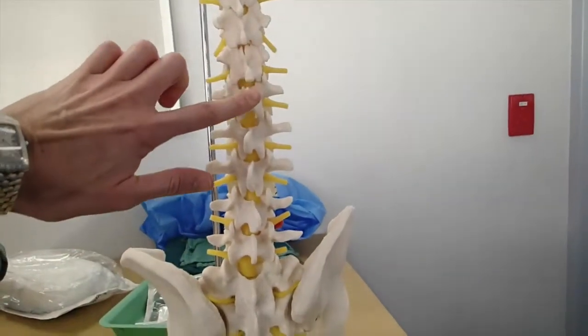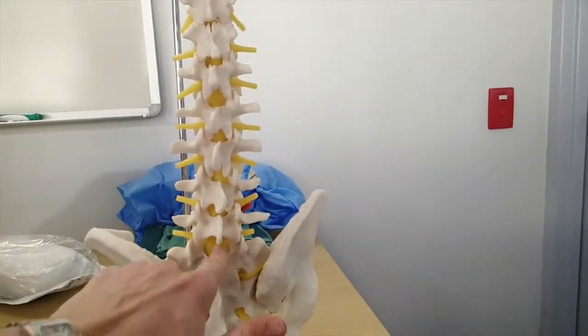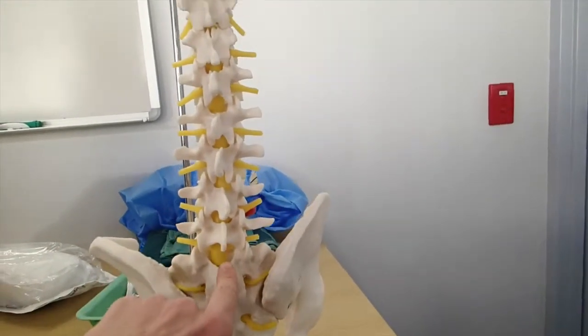And this is the gap where we need to put our needle. So you'll see when I insert it, I feel down the spine and try and insert my needle between the two spinous processes where there's a gap.